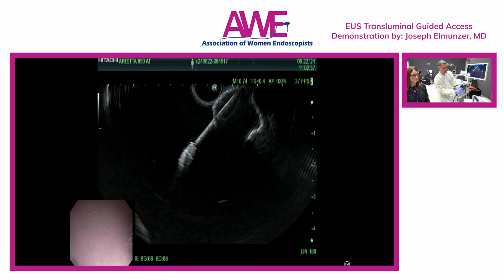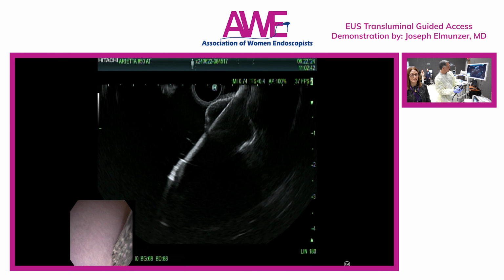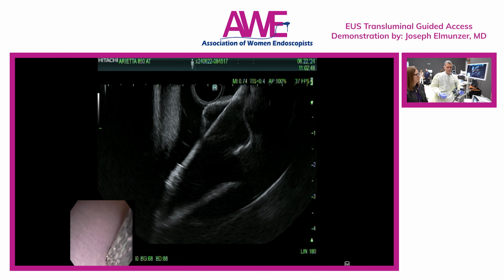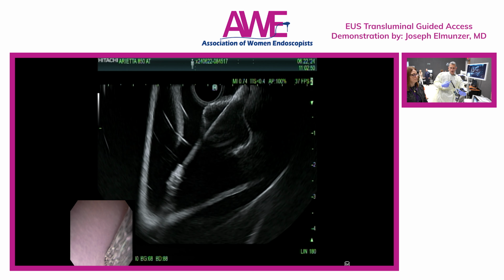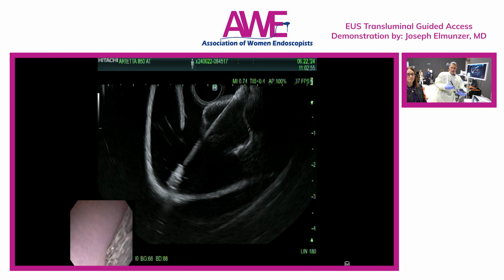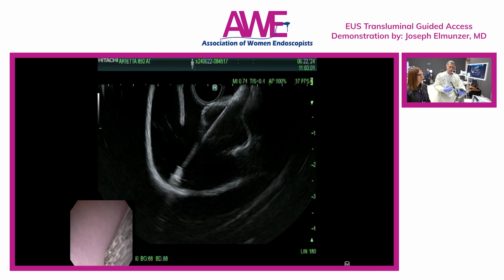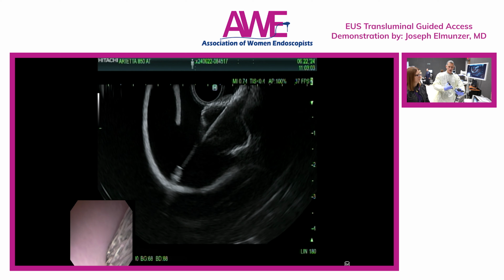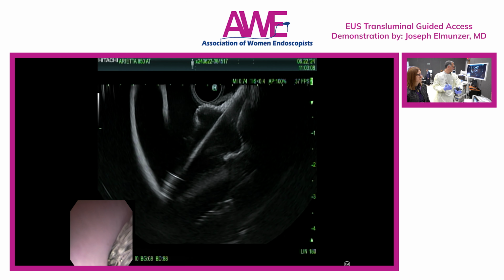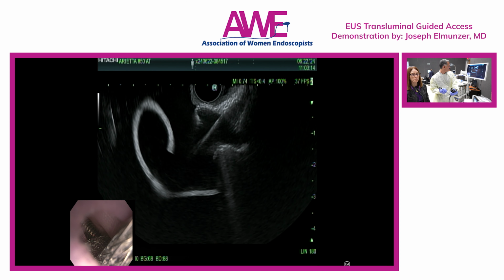Typically that can be done by unlocking the catheter hub, backing away a little bit, and then pushing out. Usually you're able to back away enough, rotating and backing away, to do that. But for those who may not be familiar, if you look at the handle here, there's a little notch right here, and that's almost like a plunger. So if you find that you brought your catheter hub out and it's still not deployed, then you can use this notch to plunge everything out, and in principle the combination of those two things should lead to proper deployment. That's definitely an important trick.